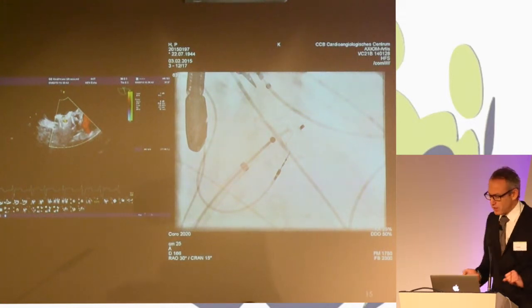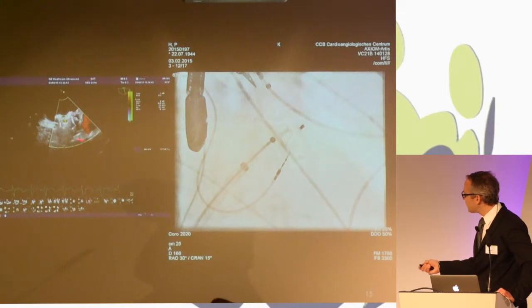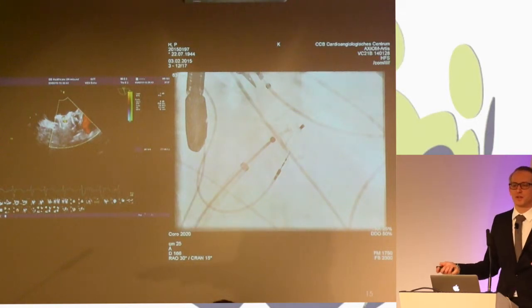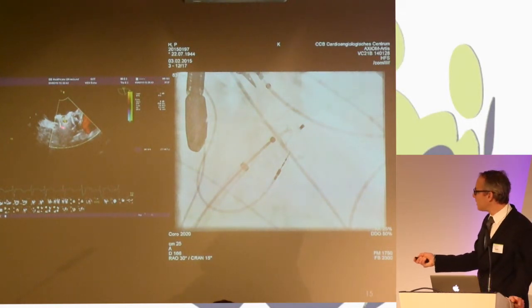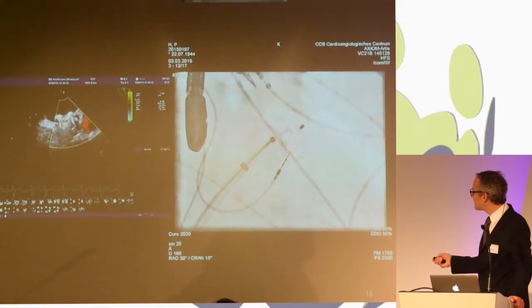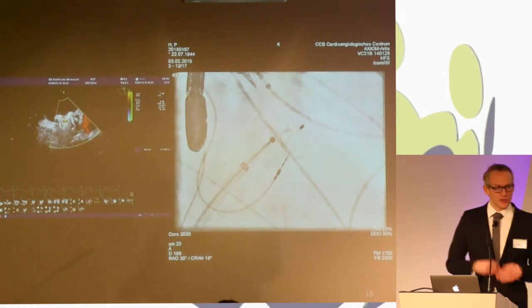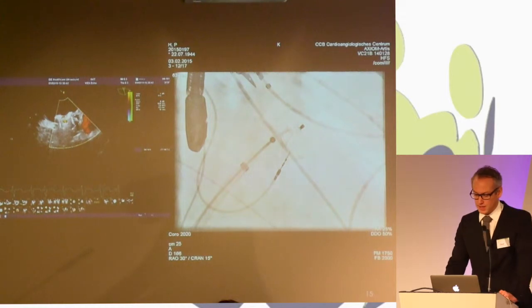I would like to bring your attention to something that I saw: the Amulet device at its anterior caudal part has a little shoulder, maybe 1 or 2 millimeters. So the lobe is not completely inside the left atrial appendage. I have the same feeling that in the X-ray, in the RAO cranial, we have what we call a little shoulder of the lobe in this case.